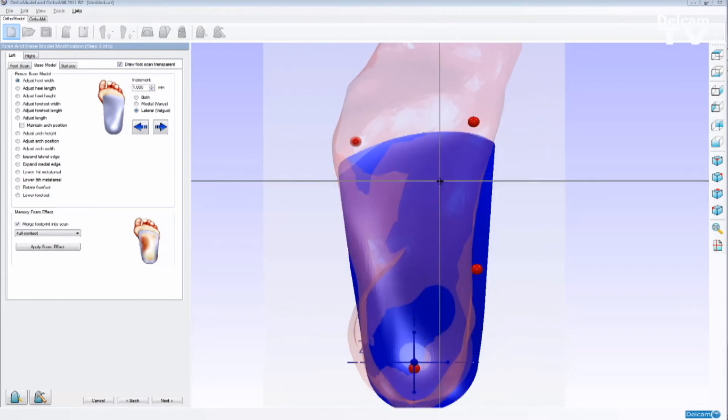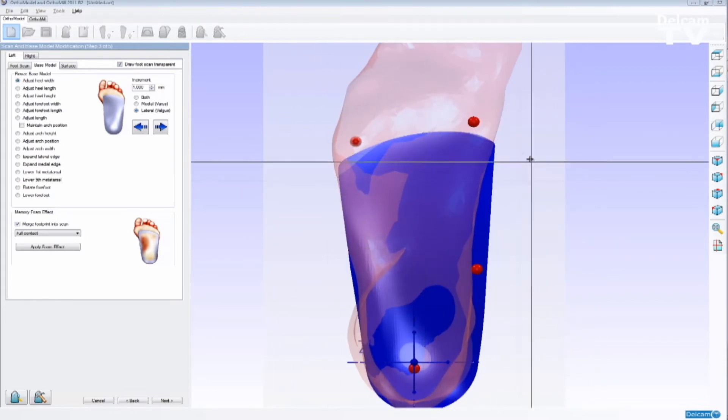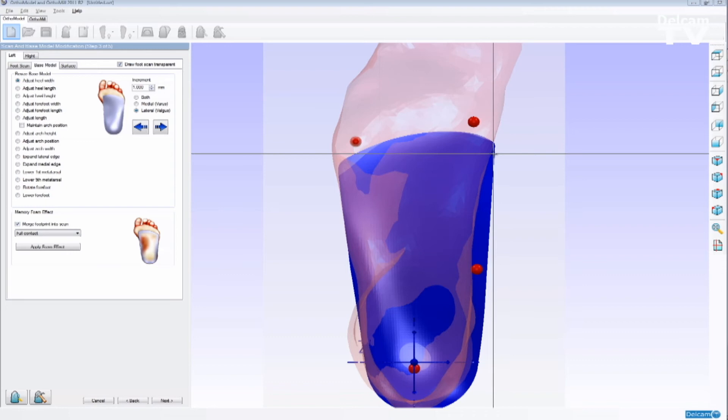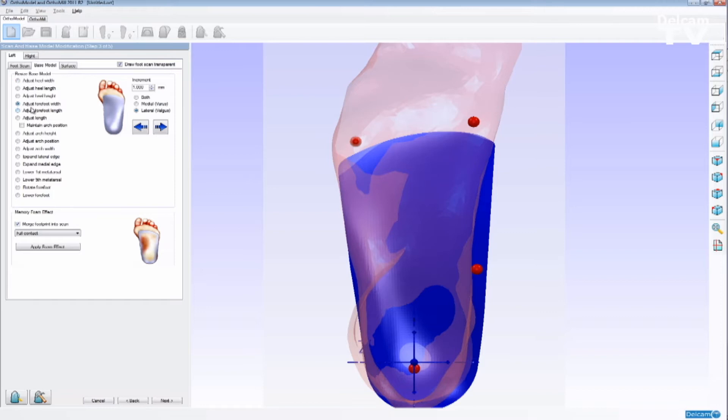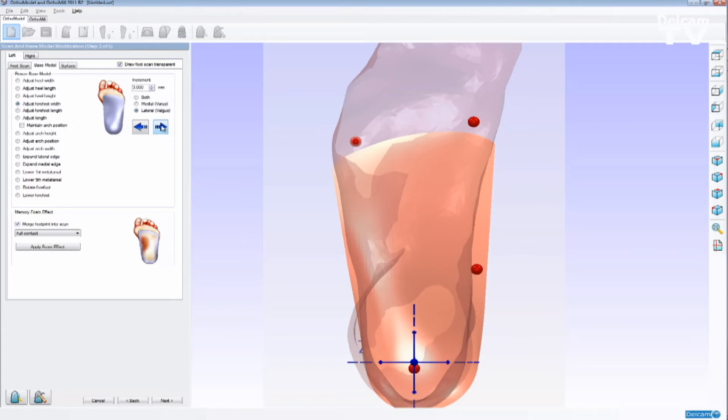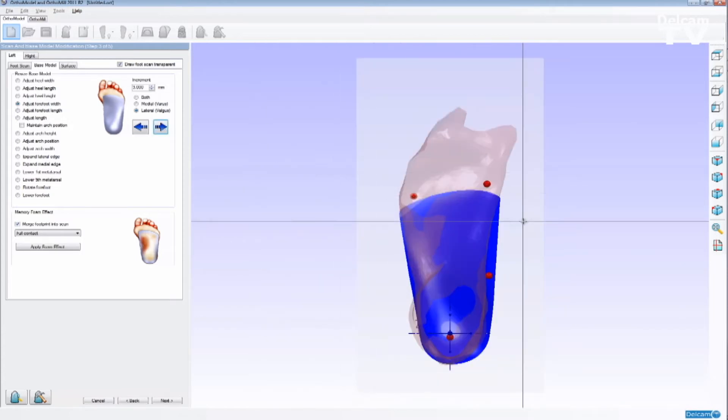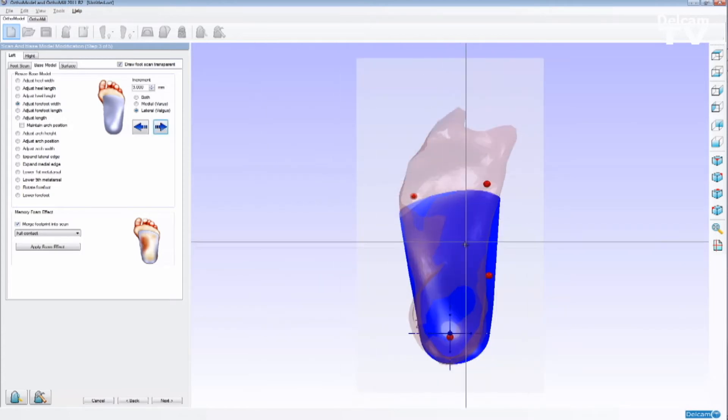For example, if I would like to make the forefoot width a little wider, I can select adjust forefoot width and I can add increments of, let's say, two millimeters, and click, and I can change the lateral edge, or the medial edge, or both of them.